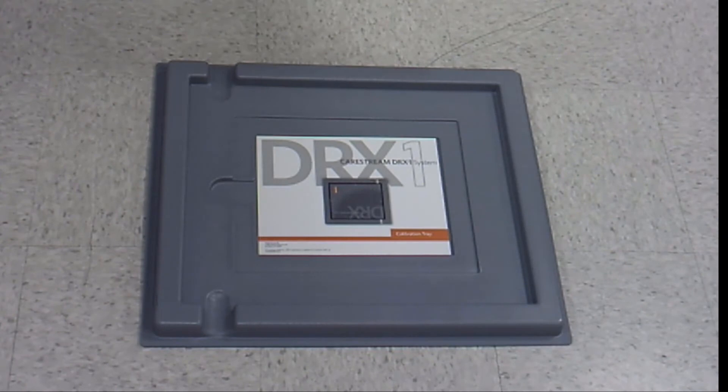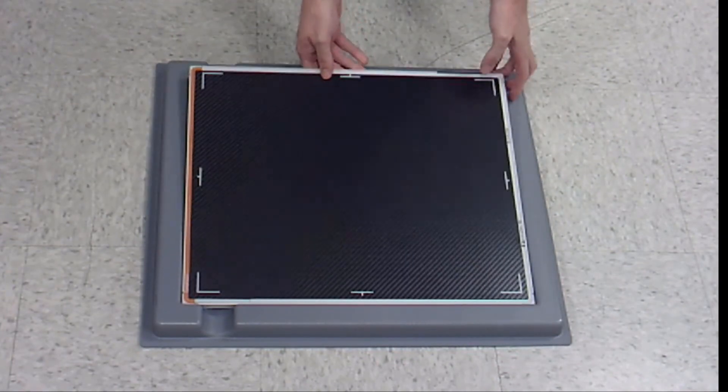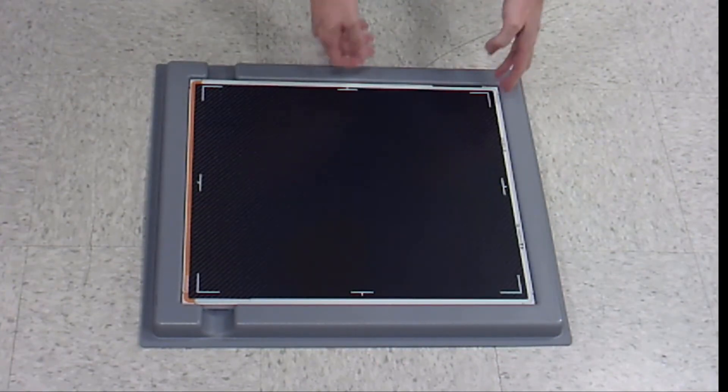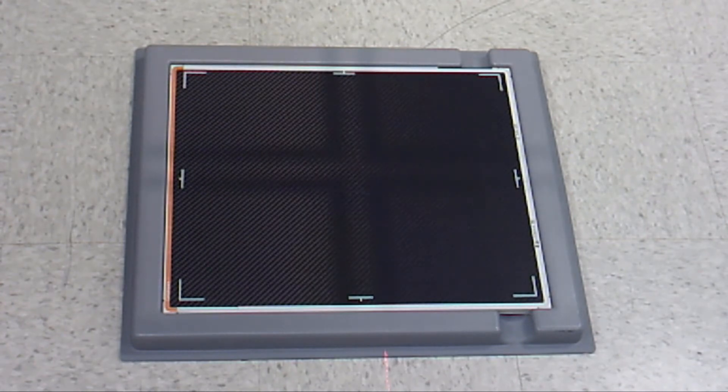Start by placing the detector in the calibration tray on the floor, away from any electrical equipment. Set the source to image distance as close to 72 inches as possible. Adjust the collimator blades to fully expose the detector.